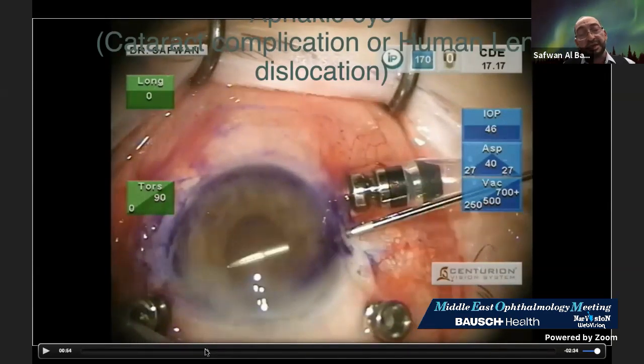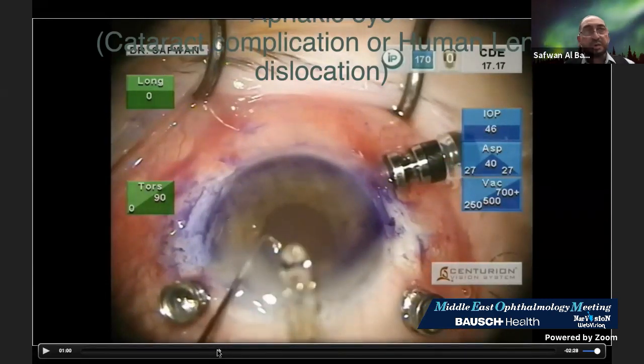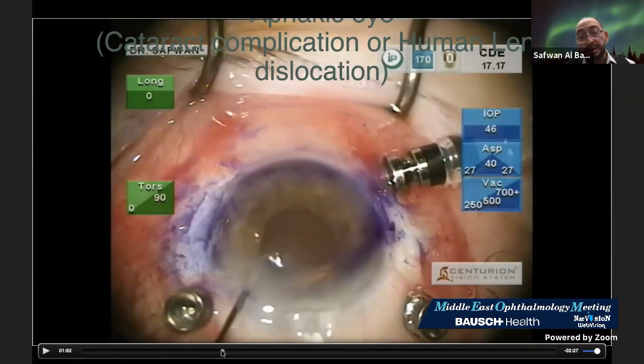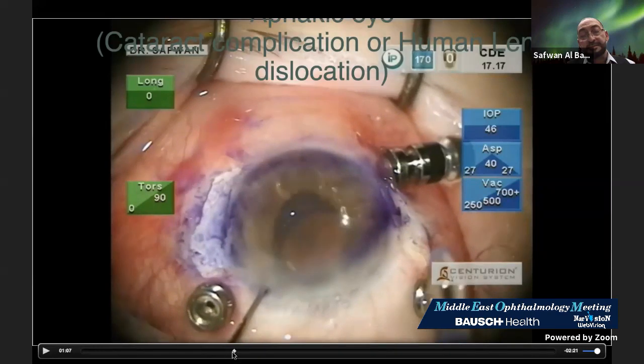See, this is the gauge 23, either serrated or tying forceps, and then implant the lens. Very clear. I'm using the usual injector, the injector for the Physiol, or any injector that is suitable for this lens. 2.2, lens in, vertical on the iris, then rotating the lens.